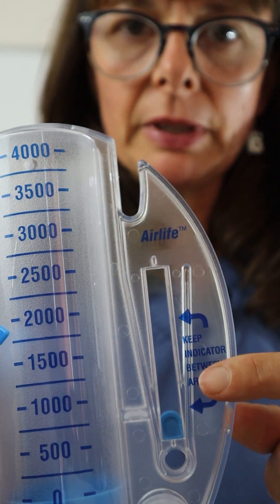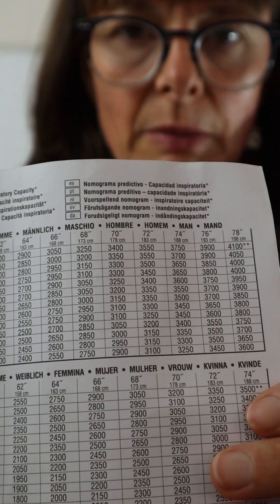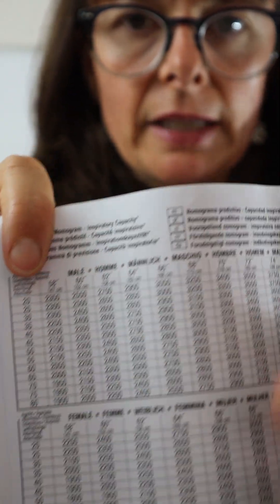It might look a little bit different for the spirometer that you have. It also comes with a chart that has normal values for patients, male and female, according to their age and their height, which is the expected lung volume.